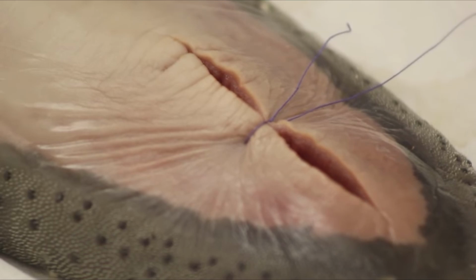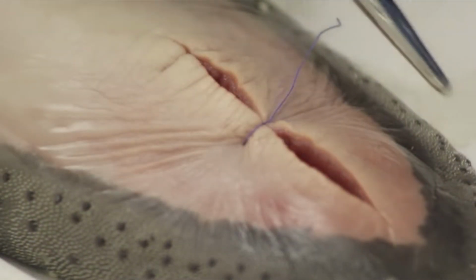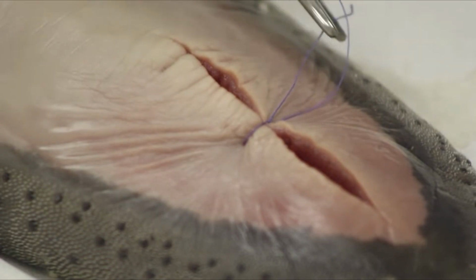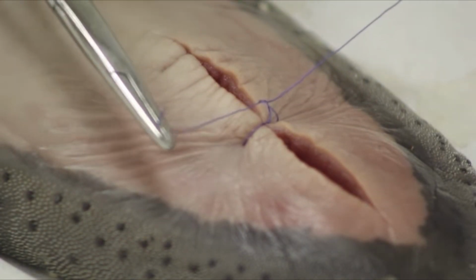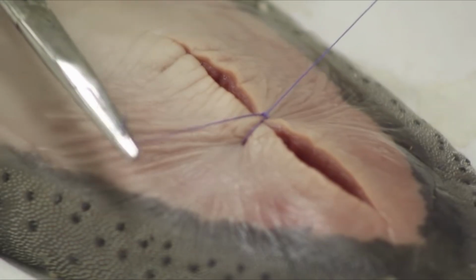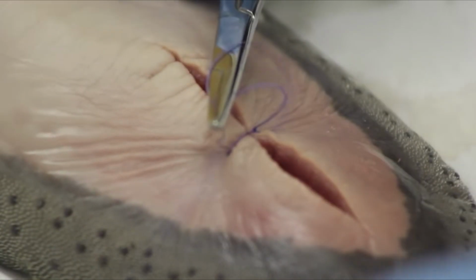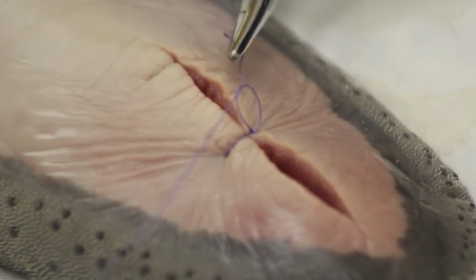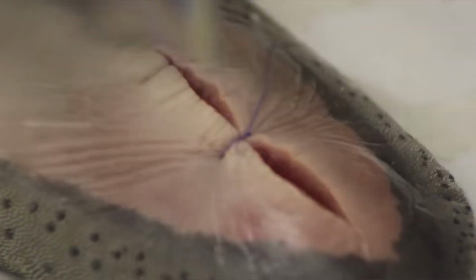Add the next throw in the opposite direction to begin a true square knot. Keep the hands low and flat as the knot is seated. Continue with additional alternating throws. Each throw should be deliberate, flat, and even on both strands. If the suture is monofilament, add extra throws for security. If the suture is braided, fewer throws may hold, but the rule remains the same. Alternate direction to keep the knot square.